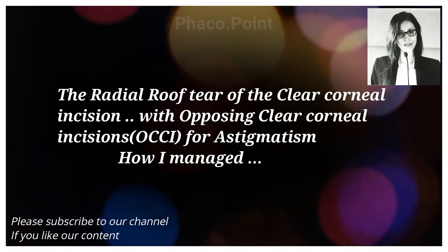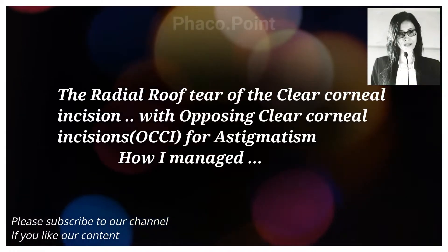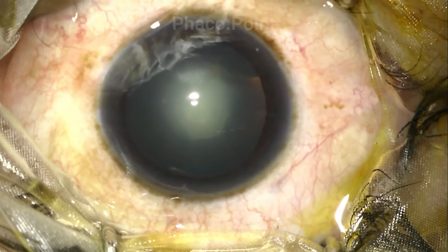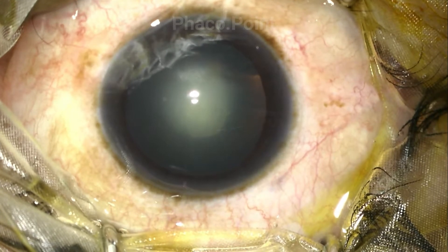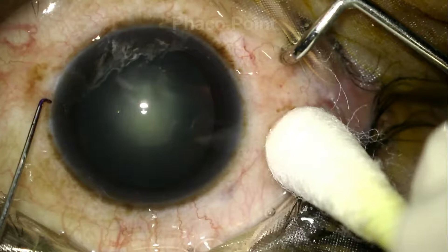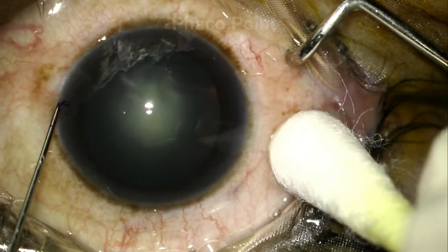The following video depicts how sometimes you may end up with a lacerated wound and how you're supposed to go ahead with the rest of the surgery and what is the possibility of the end result. It also tells you whether or not you need to take a suture in a case like this.